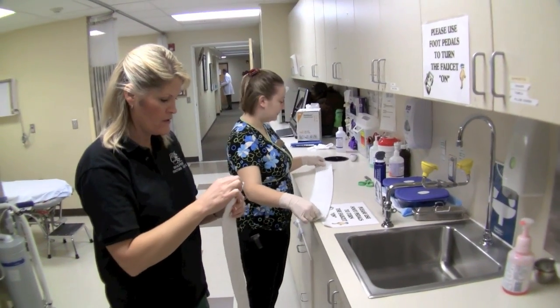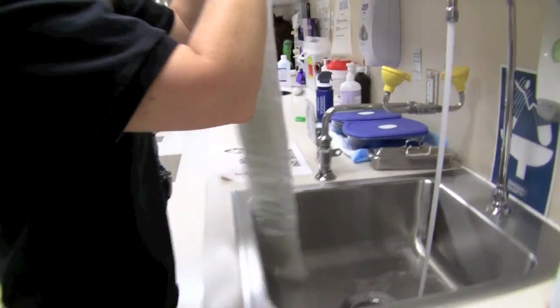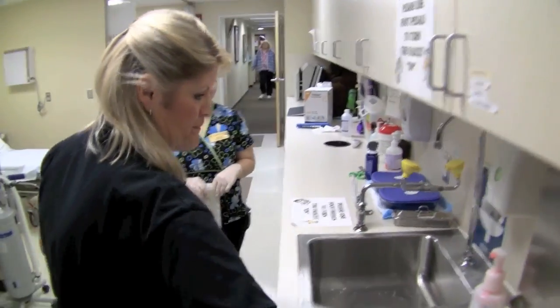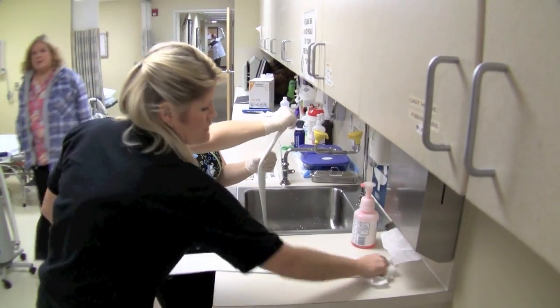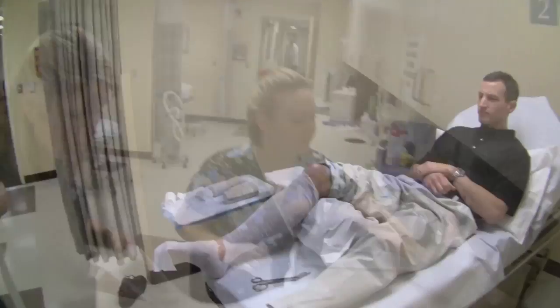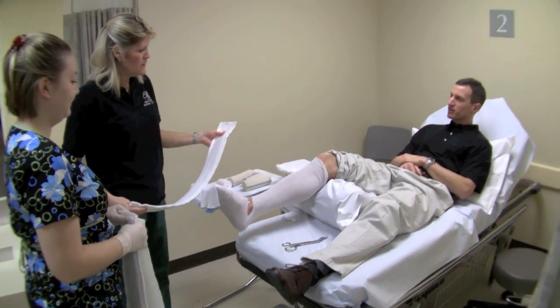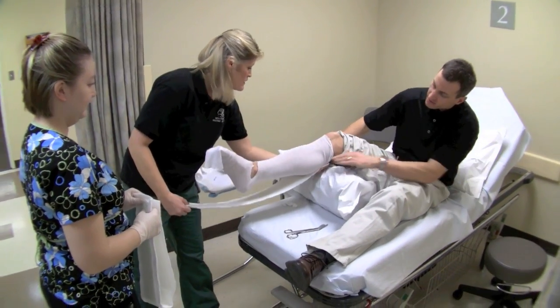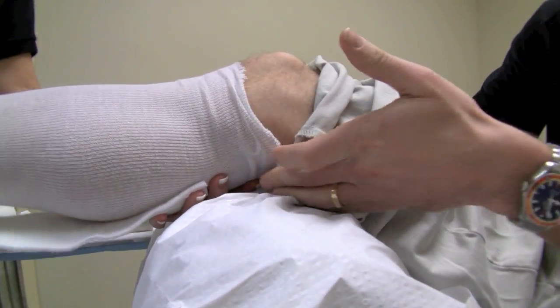The shorter fiberglass piece is opened from its pouch and a little water is added, then excess water is dried out. We have two pieces to this splint: the posterior element and the stirrup. Doctors don't want any side-to-side movement, which is why there are two pieces. The posterior element is applied starting about two finger widths below the popliteal fossa so it's comfortable.